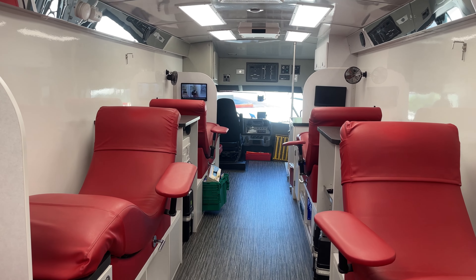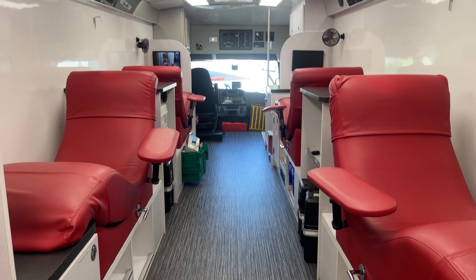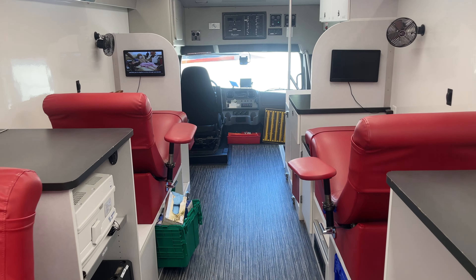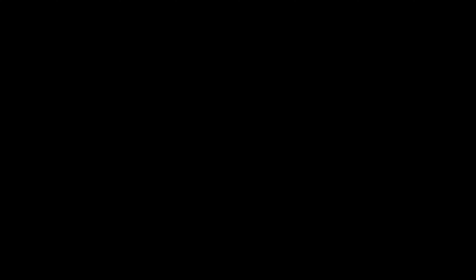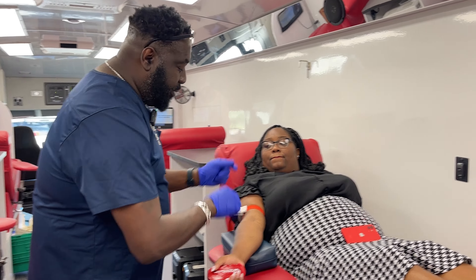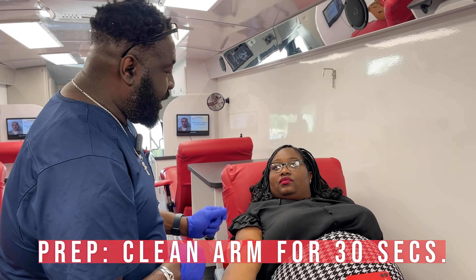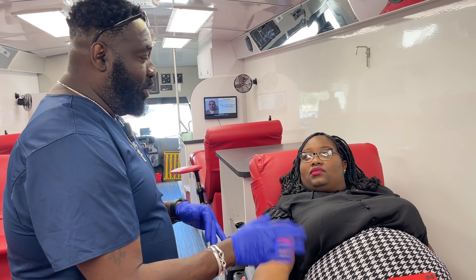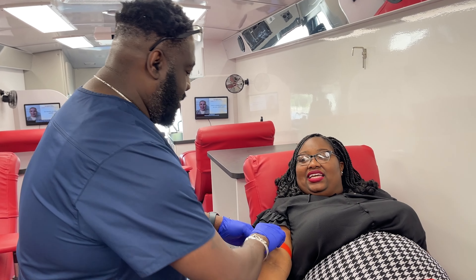Once you're all complete with your screening process, you'll come and have a seat here on the chair to get ready for your mobile donation. Right now, we're going to prep your arm. We're going to clean it for 30 seconds. After the 30 seconds, we're going to let it dry for another 30 seconds, and we'll get you started right away.